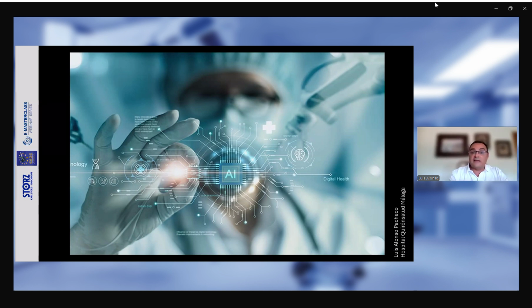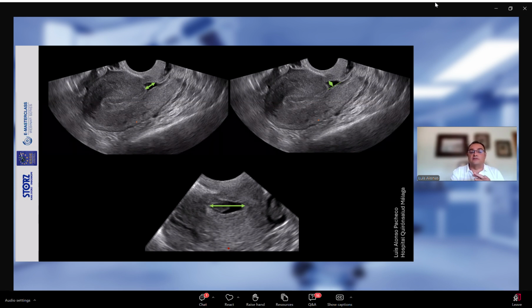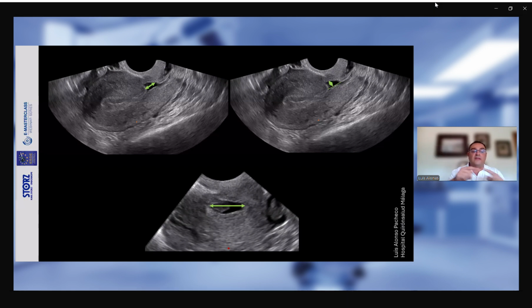And personalized medicine starts with a right diagnosis of this problem, mainly based on clinical symptoms and the use of 2D ultrasound. The niche is defined by the presence of an anechoic area, usually with a triangular shape, at the site of the previous cesarean section, in which we have to define the length, the height, and, rotating our probe 90 degrees, the width and the existence of branches.